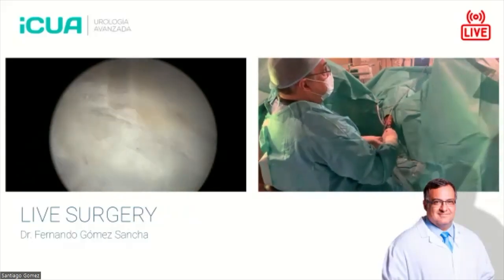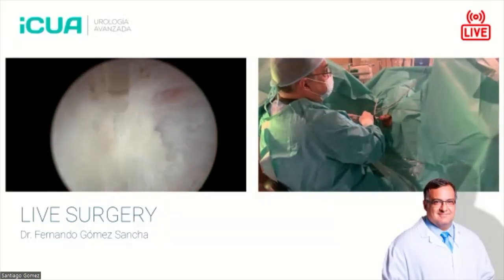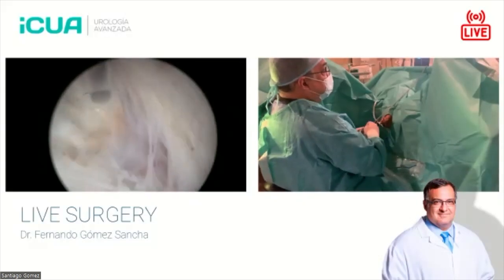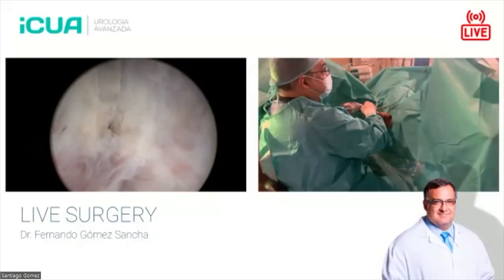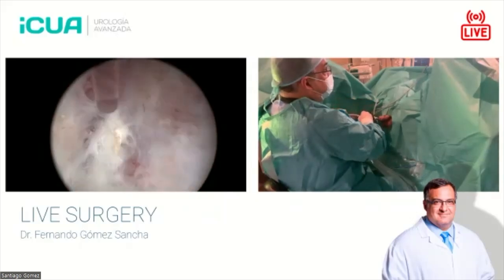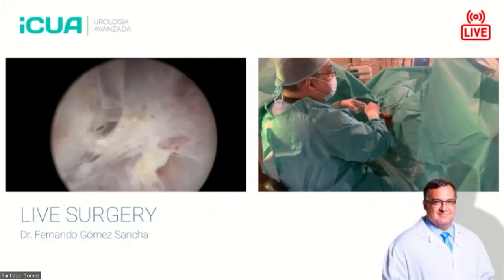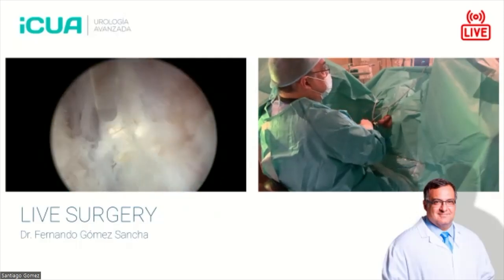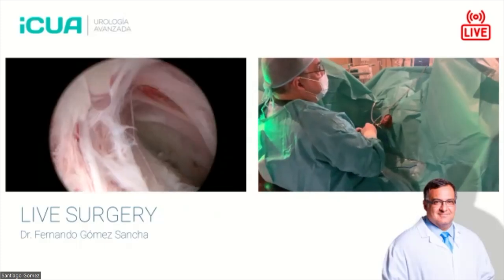Okay. So you see here, I'm coming up, but still I'm not forcing my way up. I'm just trying to carry a nice line that then I can follow. You see, the line of dissection is coming downwards like this, and it has to connect with the posterior line. This is the posterior line that we marked before. This way we are oriented. We have entered the right depth for dissection, and then in order to carry this dissection towards the bladder neck, we just have to judge if the depth of the dissection that we are taking is good enough.